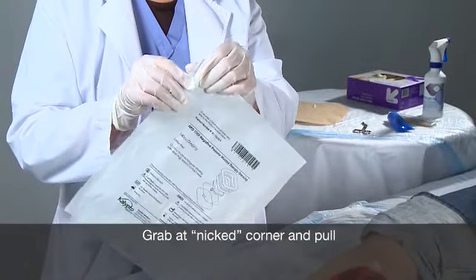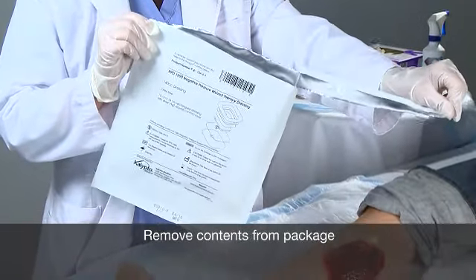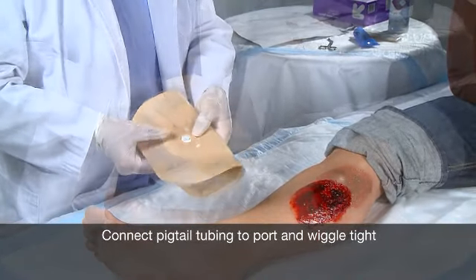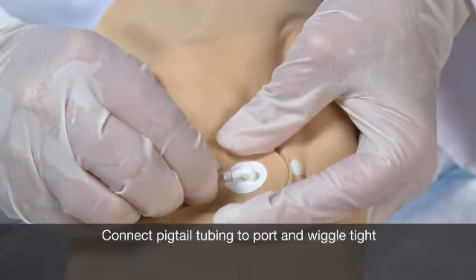Once you've confirmed the correct wound kit, open the package by grasping the nicked corner of the package and pulling. After the package is open, remove the contents. Next, connect the pigtail tubing by folding the wound kit in half with the pad side in, and push the end of the pigtail tubing over the wound kit port.